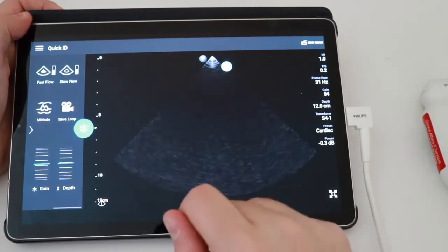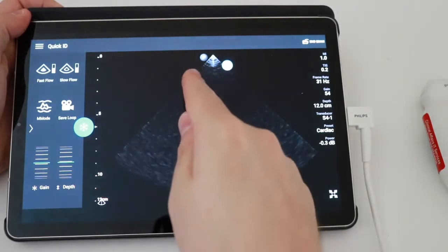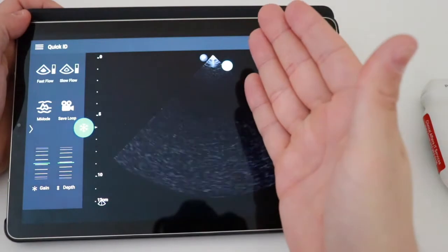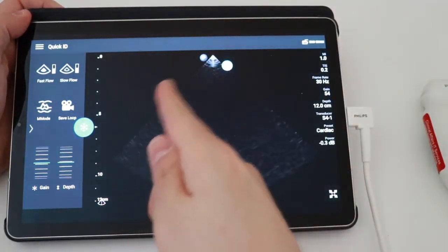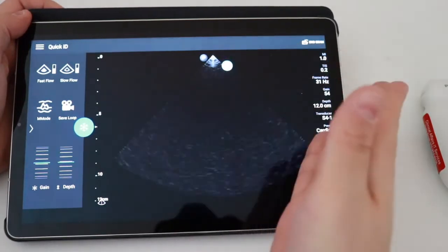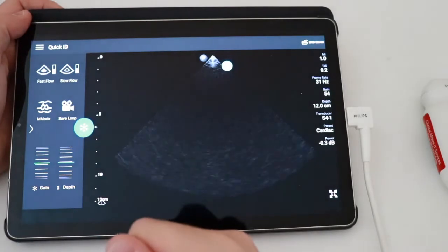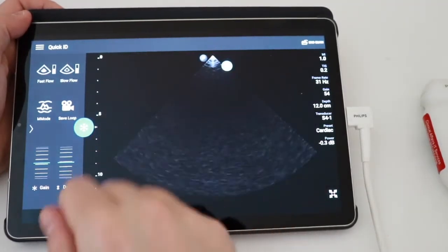One important thing for the cardiac exam I actually want to show you is the probe marker. So depending on which type of exam you're doing or which convention you're using, the probe marker is sometimes on the left of the screen or the right of the screen. Cardiologists tend to put it on the right of the screen. We're going to put it on the left of the screen because that is the EM convention and it makes it consistent with our other exams.